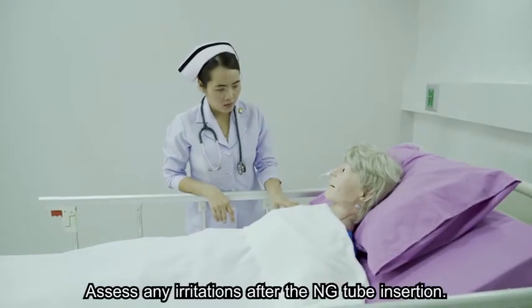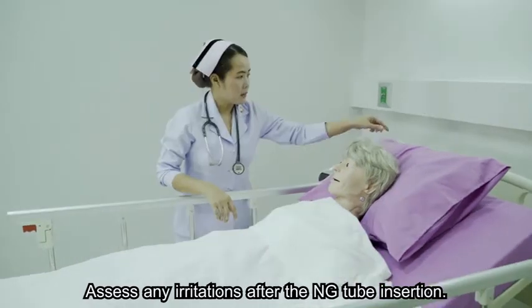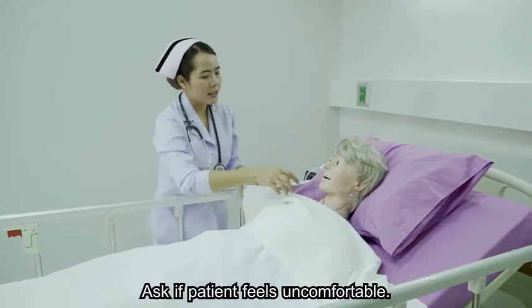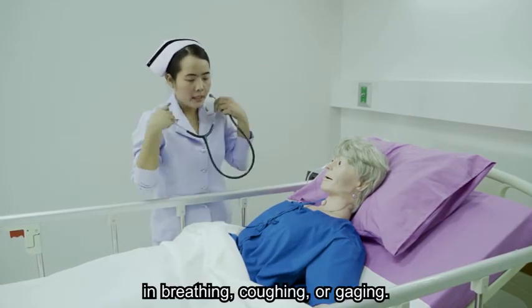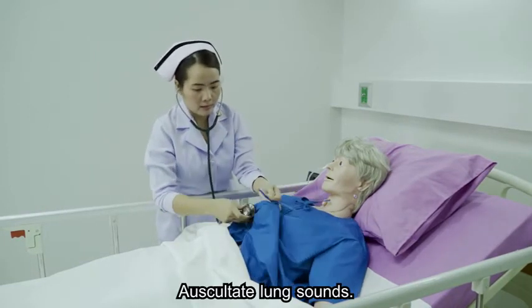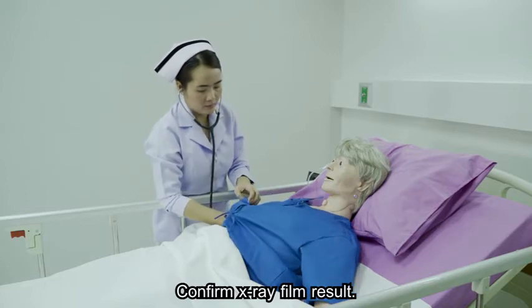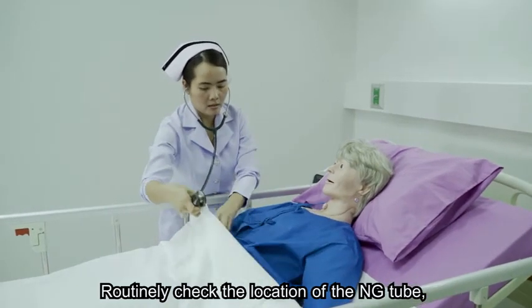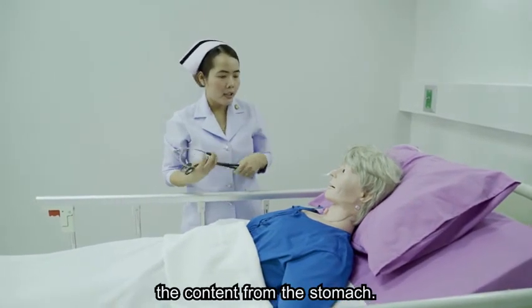Evaluation. First, assess any irritation after the NG tube insertion. Second, ask if the patient feels uncomfortable. Third, observe the patient for any difficulty in breathing, coughing, or gagging. Fourth, auscultate lung sounds. Fifth, confirm the X-ray film result. And finally, routinely check the location of the NG tube as well as the color and characteristics of the content from the stomach.